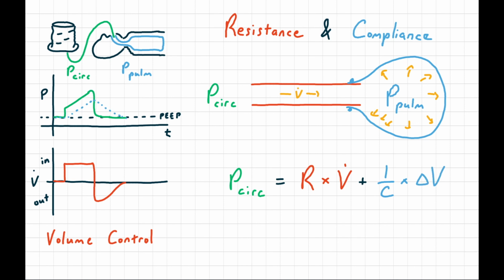So this really is your fundamental equation that defines what the pressure is doing in your ventilator system. It's providing flow through the endotracheal tube and airways, and then it's providing pressure to distend the lungs with your tidal volume. So there's a clinical diagnosis question that comes up every once in a while, maybe in an intensive care unit, maybe in an operating room.